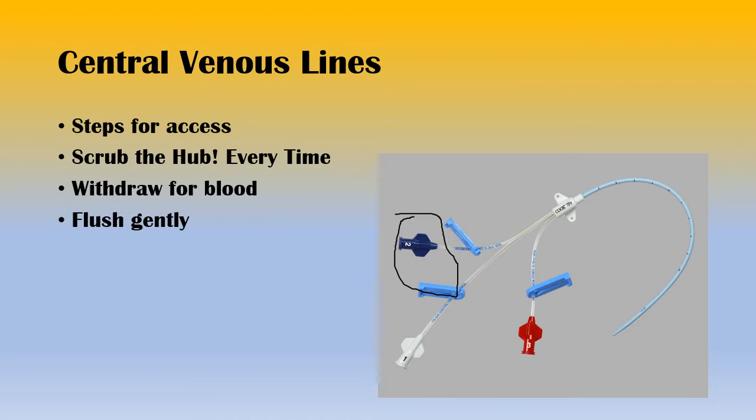It's really just to have a couple different points to plug in medicine. If you have a pressor running through one, you can use IV fluid on the other. Leave one open for medicine pushes. It really doesn't matter. You'll also notice that the catheter is shorter than the PICC line. It's because it's not going into the vena cava as the PICC line was. We just want to get into venous circulation.